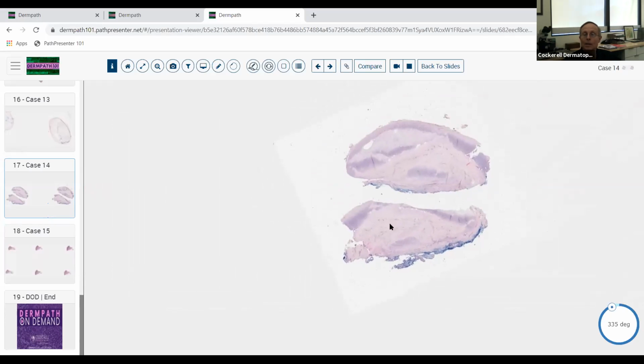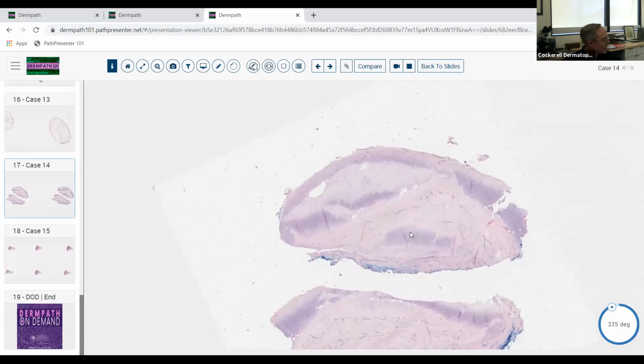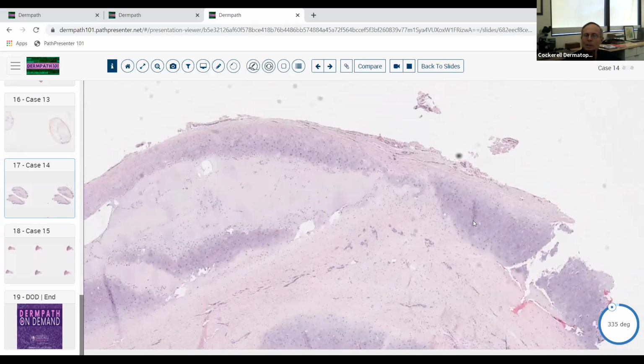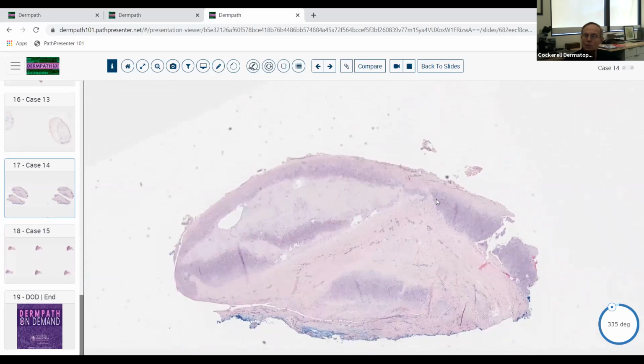Okay, here it looks almost again like it might be some type of an incision. This looks like somebody had to cut deep into this thing. And what part of the body are we on? Well, we're not sure, but what is this material here? As we go to higher magnification, you can see that there's cartilage. There's cartilage.